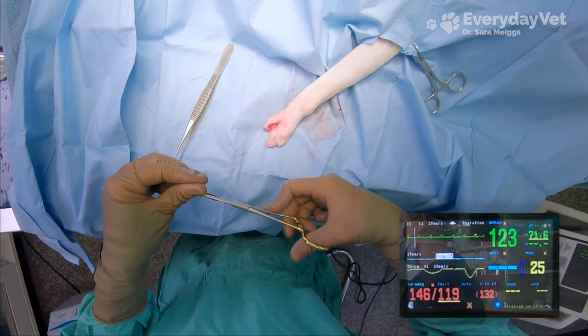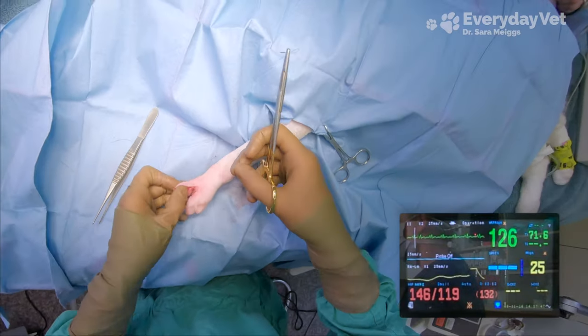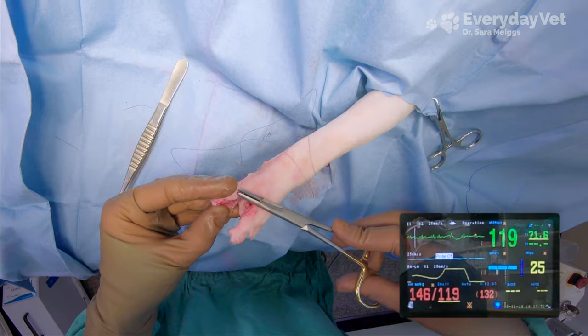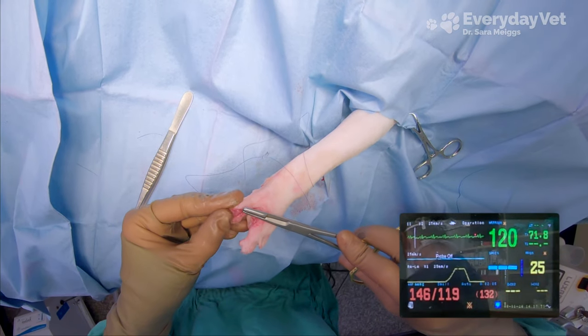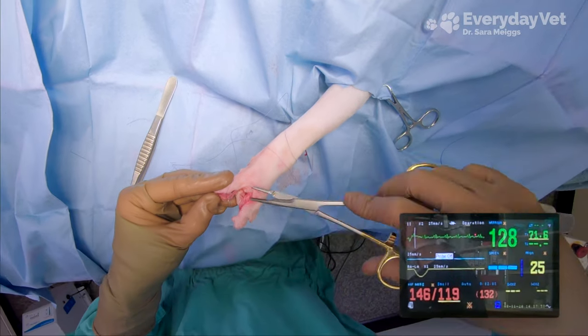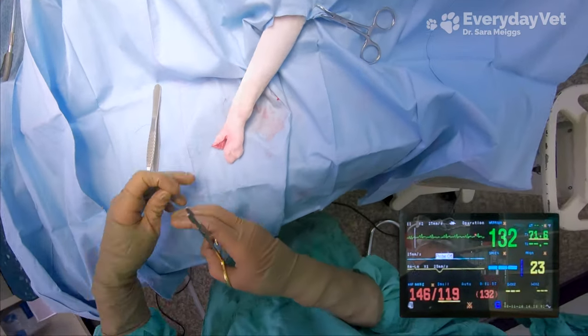If I had just shown you this screen and it was the only blood pressure reading I'd given you for this whole surgery, you'd be like, wow, that's pretty high. But that's not the case, because we had all of those readings for the rest of the surgery, so we know that he isn't running high blood pressure. This was one reading out of many, so I don't trust it at all. We'll see what the next reading shows.